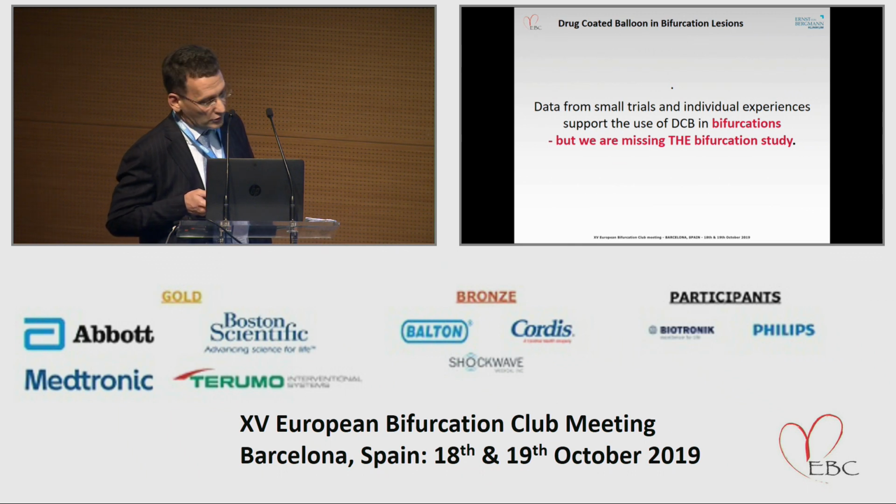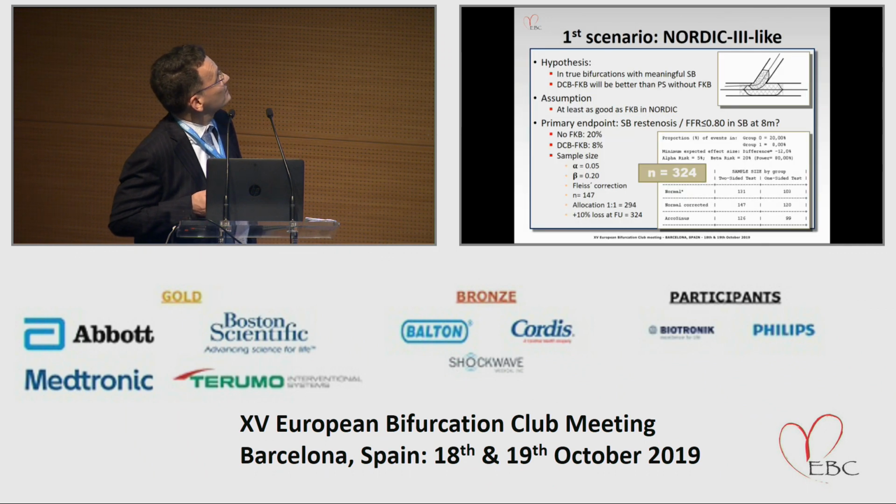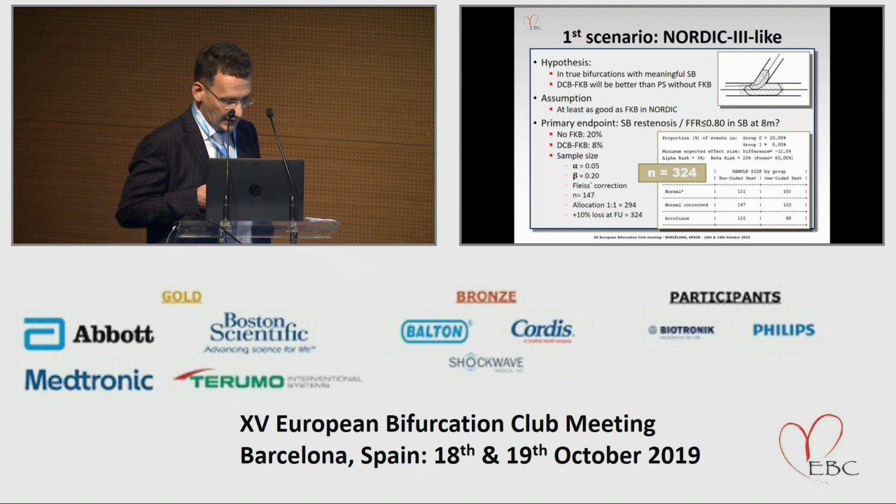Still, according to all of the speakers, and this is the message that was conveyed from the session, we are missing the bifurcation study. The fifth speaker, Juan Luis Gutierrez Chico, came up with several scenarios for future studies, detailing a first scenario, a Nordic 3-like, like he called it, where it could be hypothesized that in true bifurcations with meaningful side branch, DEB FKB would be better than provisional stenting without FKB.